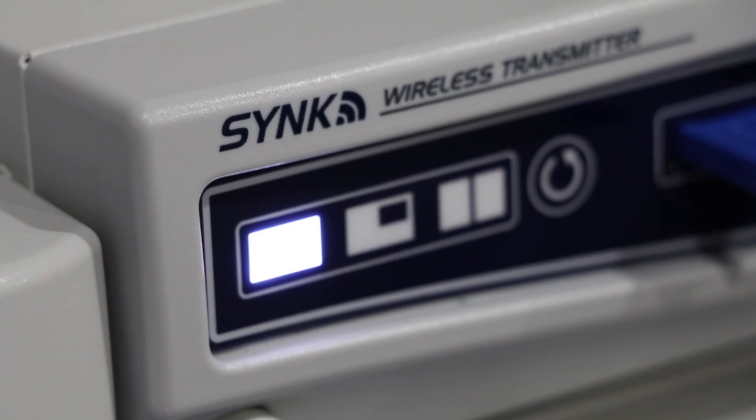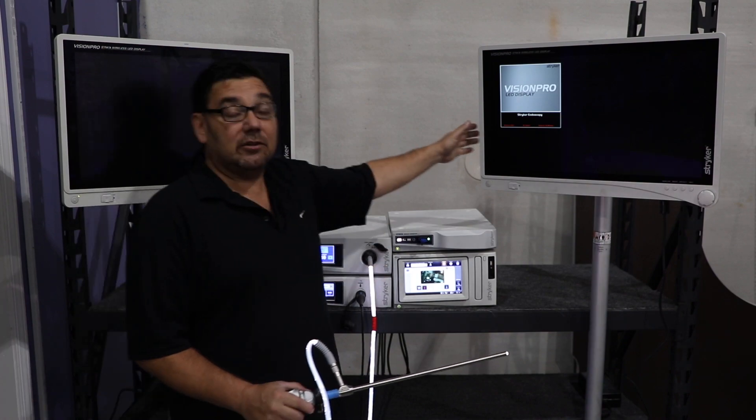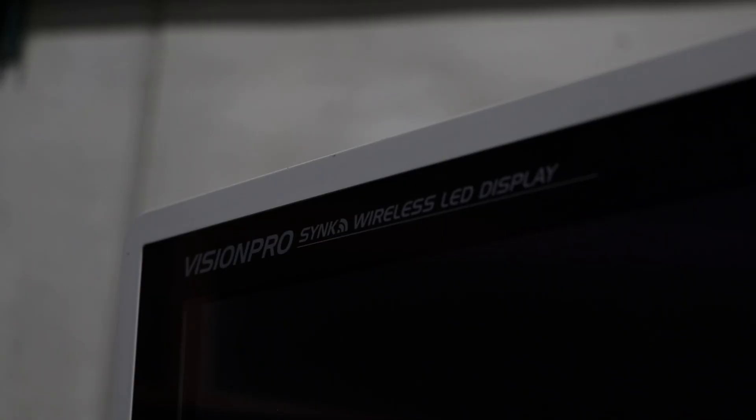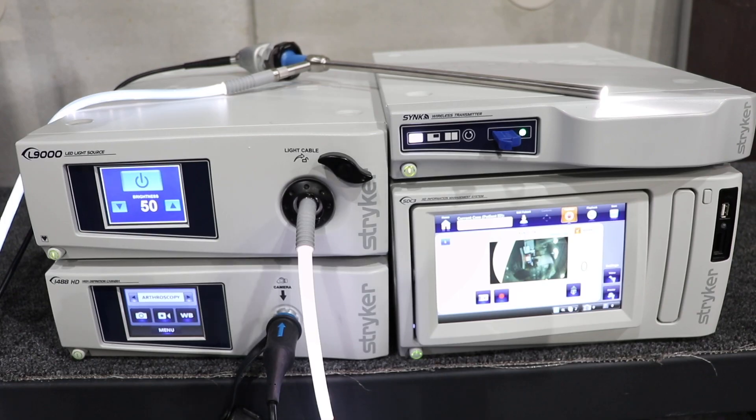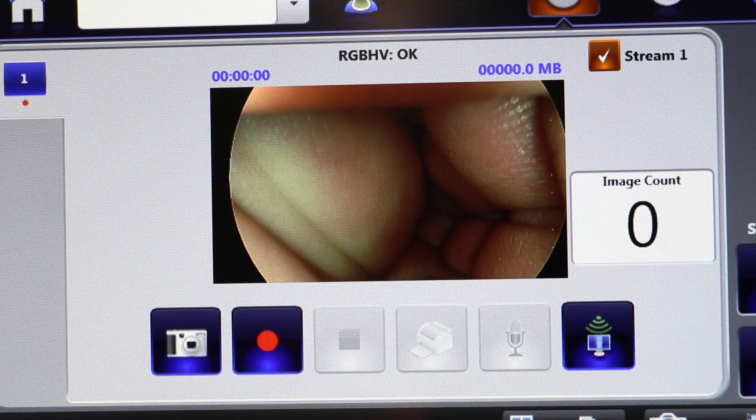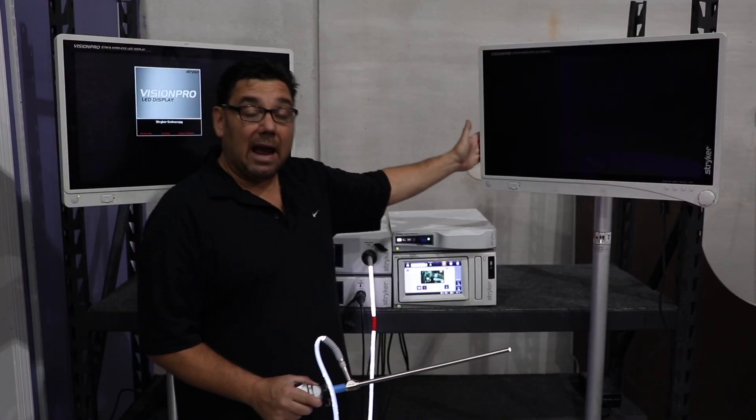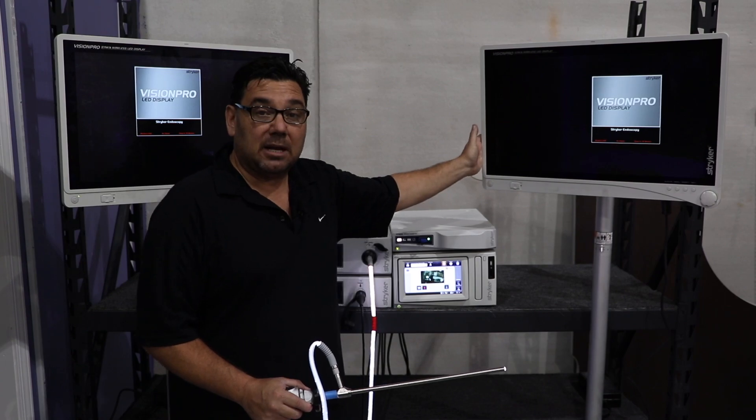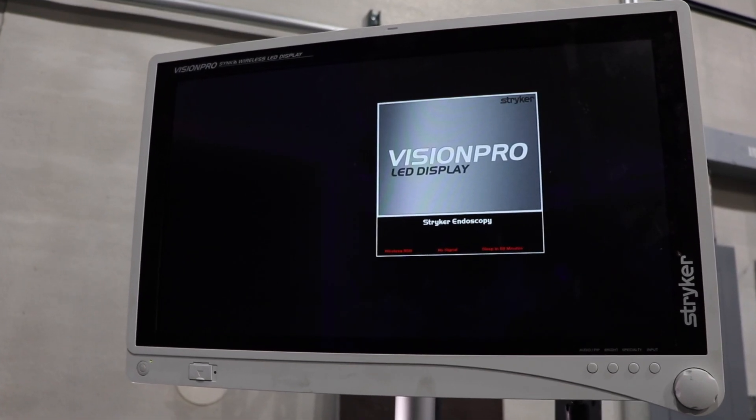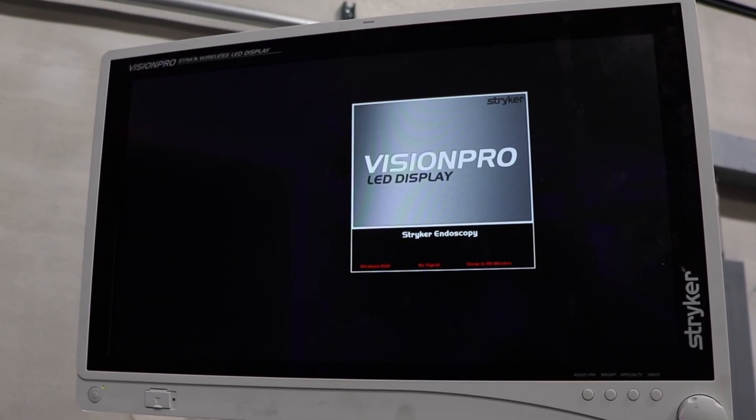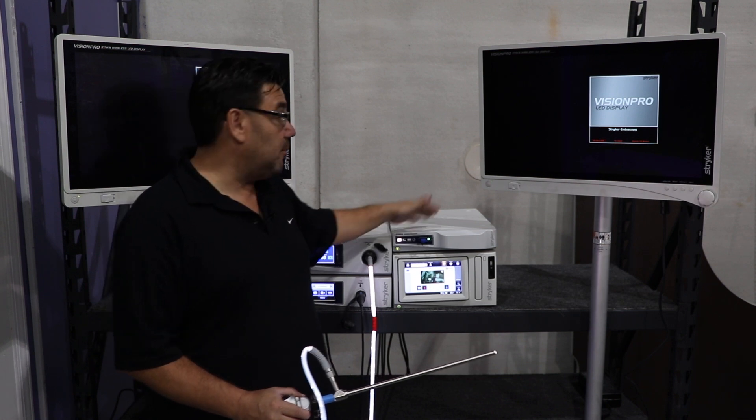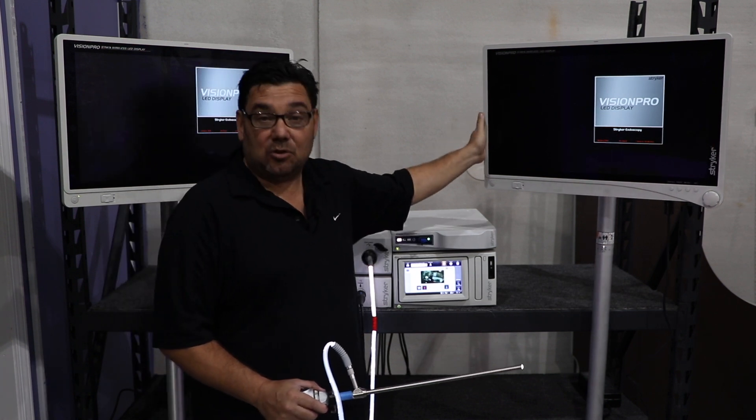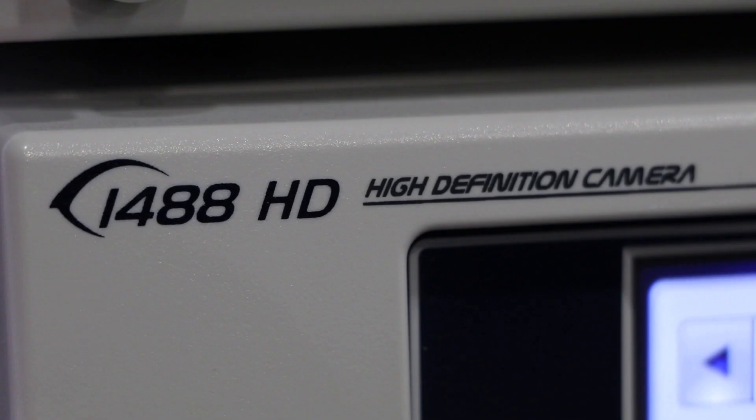This is Stryker's sync technology with the Vision Pro monitor. As you can tell, we have everything hooked up and we have an image on our SDC or digital capture, but we don't have an image displayed on the monitor. This is because you have to sync the monitor to all of the equipment and then to the actual display.